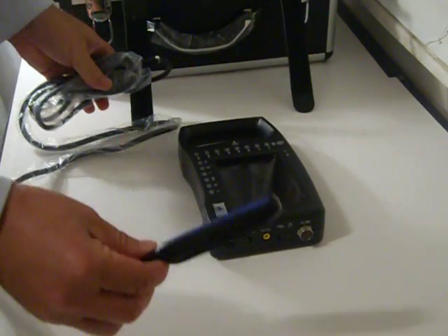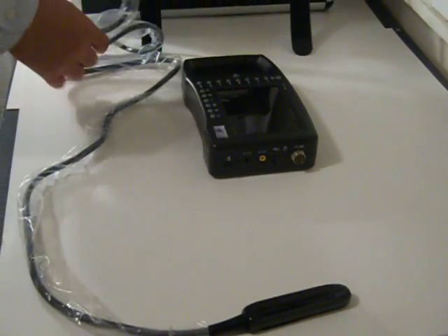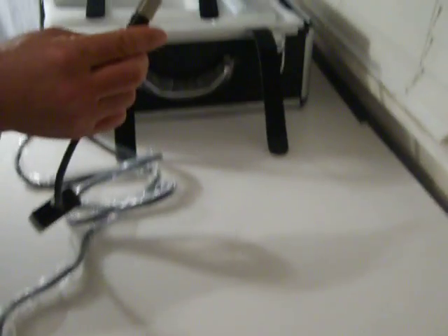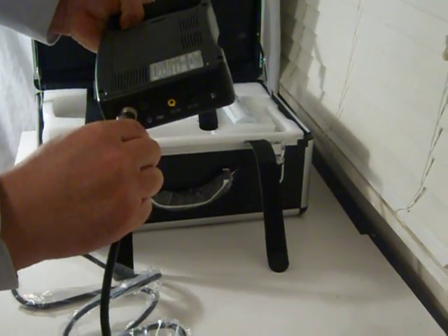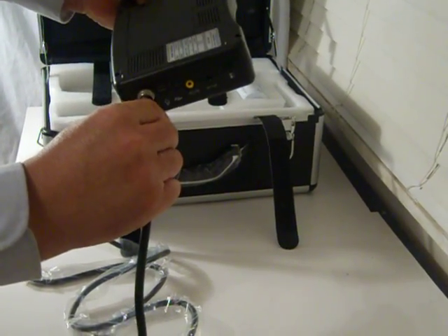This is a rectal linear probe — 5.5, 6.5, 7.5 megahertz. It's easy to connect the probe. It's better to connect the probe when the scanner is off, as it will protect the probe, which means a longer life for the probe.